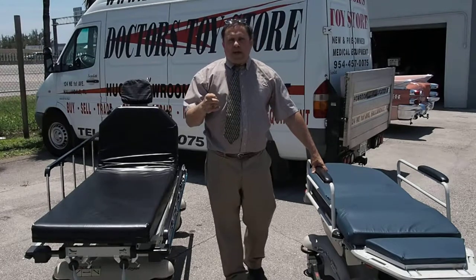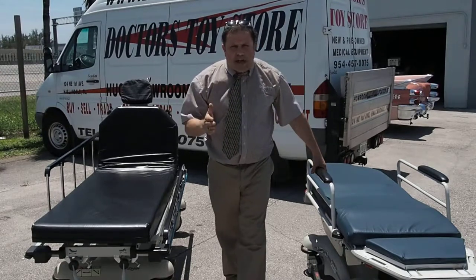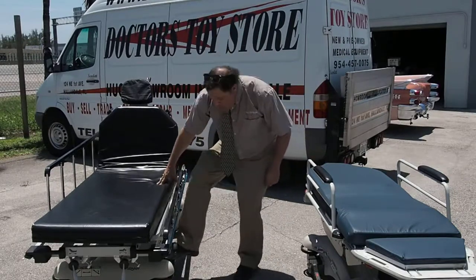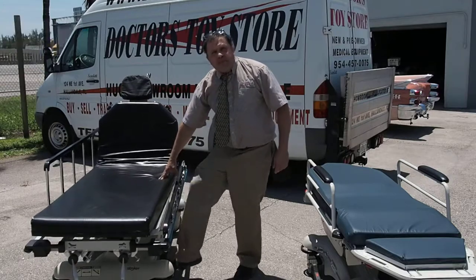I'm Rob at the Doctor's Toy Store, and I'm going to talk about stretcher chairs today. A lot of doctors buy stretchers, but this is a typical stretcher. It's got your down position and your manual controls.